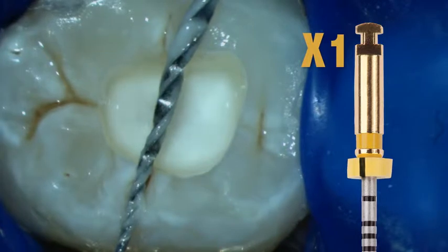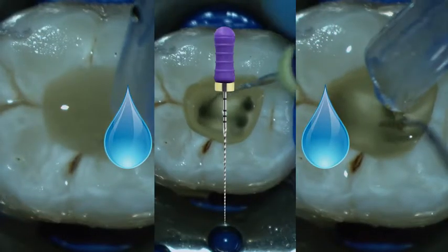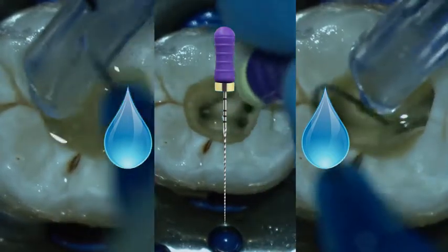As can be seen, significant amounts of dentinal debris are generated and carried coronally with these instruments. Following the use of the X1, the canals are recapitulated with the number 10K file and irrigated with copious amounts of sodium hypochlorite.